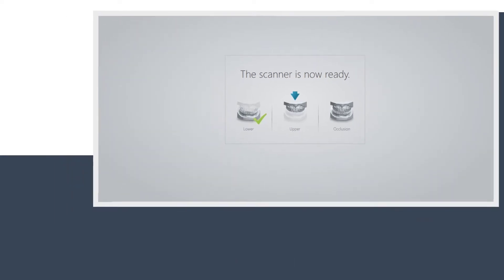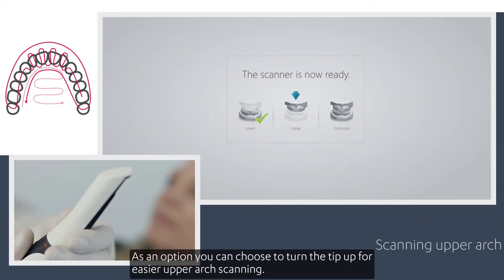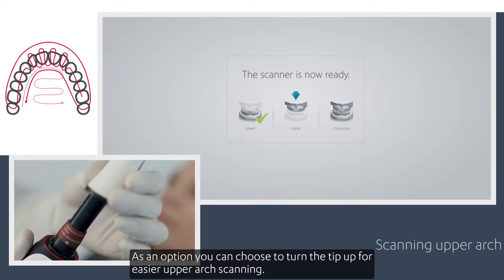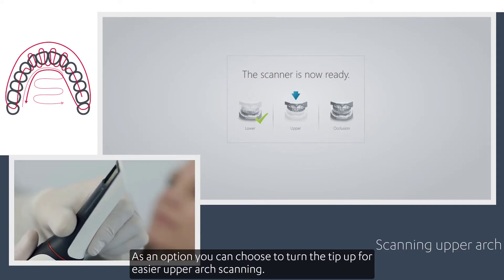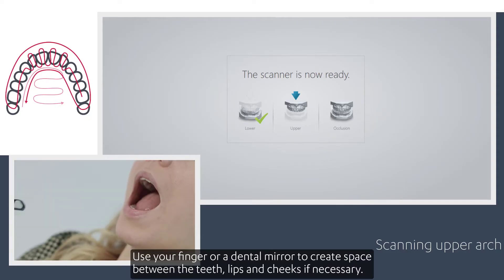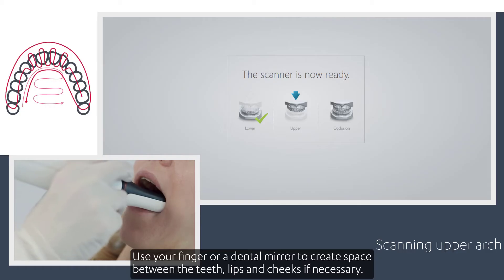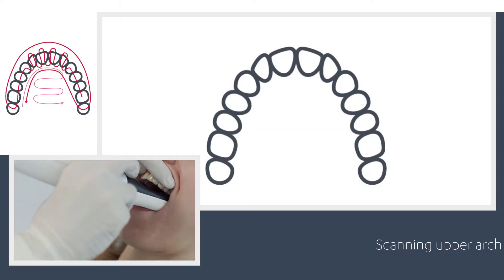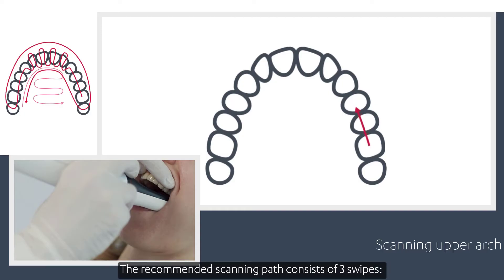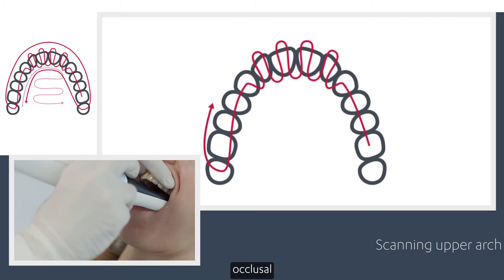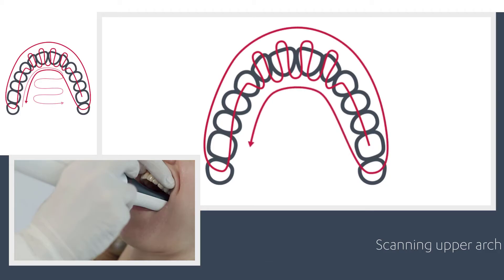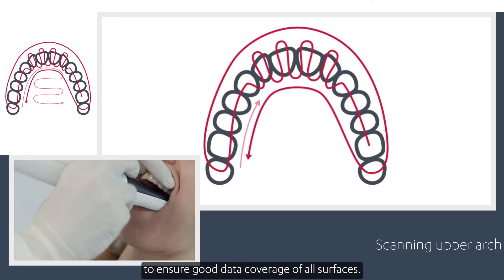Upper arch. As an option, you can choose to turn the tip up for easier upper arch scanning. Use your finger or a dental mirror to create space between the teeth, lips and cheeks if necessary. The recommended scanning path consists of three swipes — occlusal, buccal and palatal — to ensure good data coverage of all surfaces.